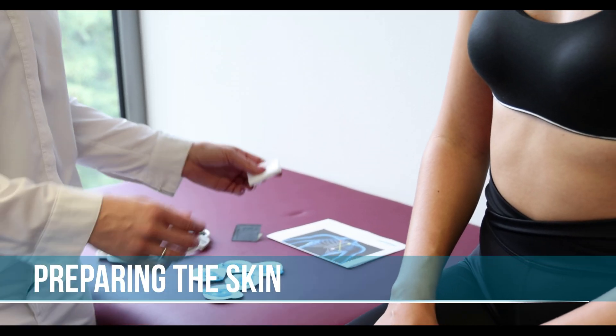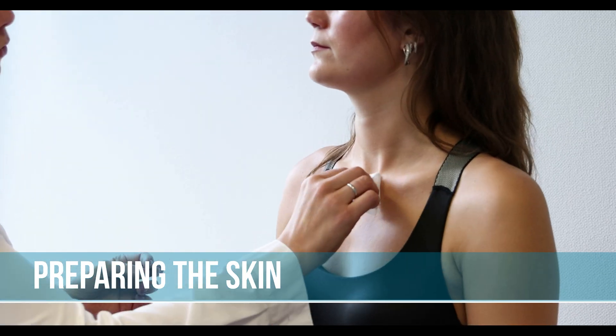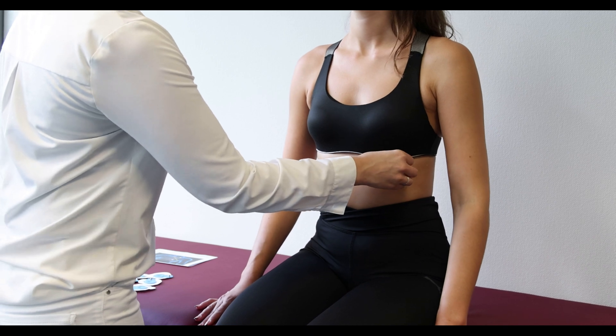Please clean the areas of the skin where the electrodes will be placed, for example using an alcohol swab. Hairy areas must first be shaved and then cleaned.